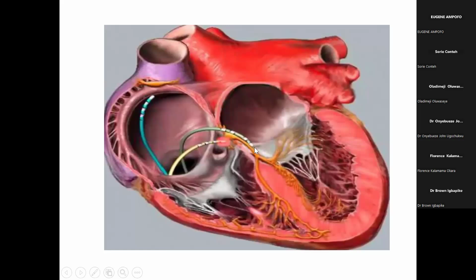All they are saying is the number of electrodes on that catheter. So for the CS catheter, it can carry up to 10 electrodes, so it will be decapolar. All those dots you see there, you count 1, 2, 3, and it will go up to 10. Each catheter can be bipolar, tetrapolar, but most of the time bipolar.